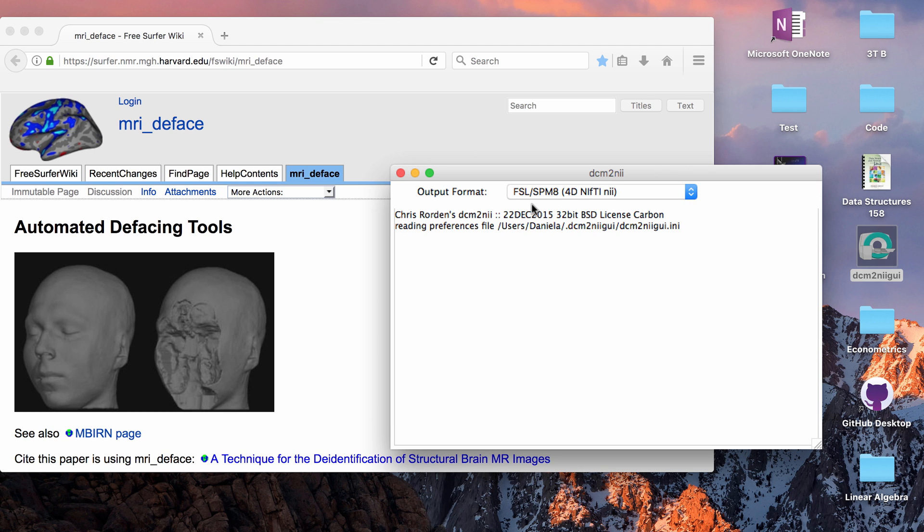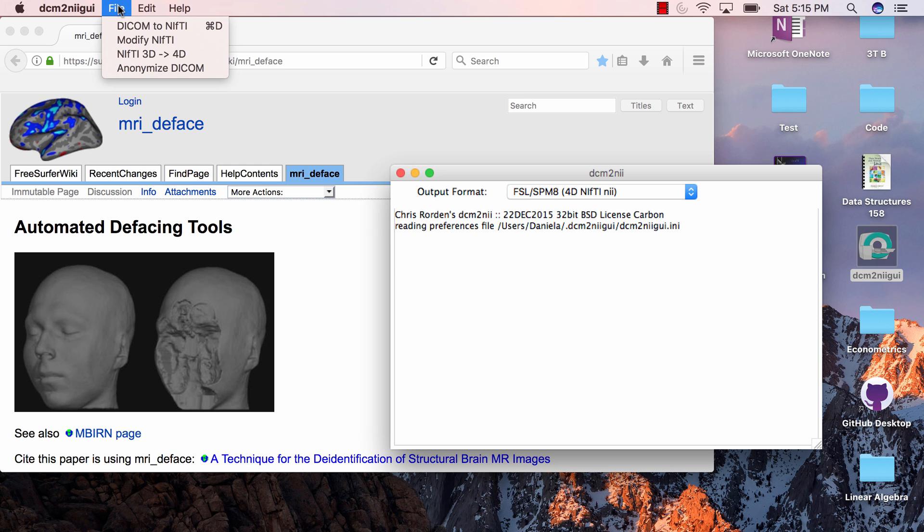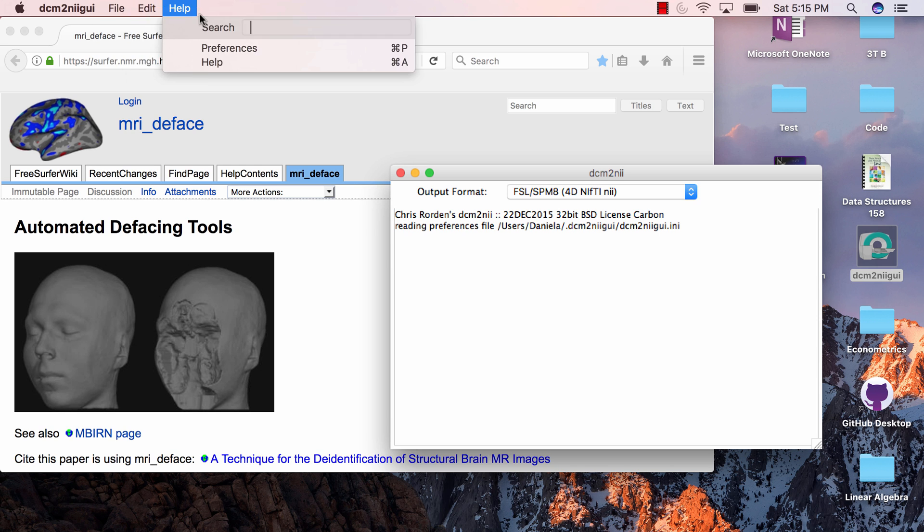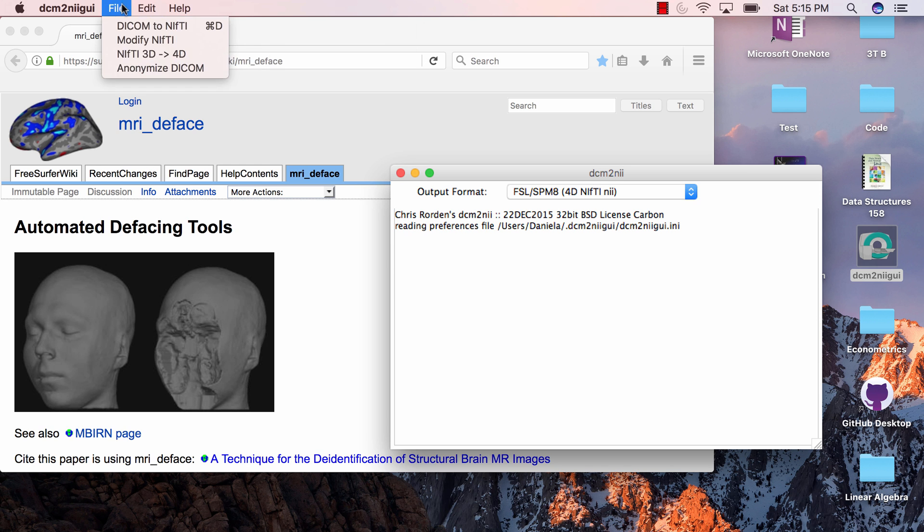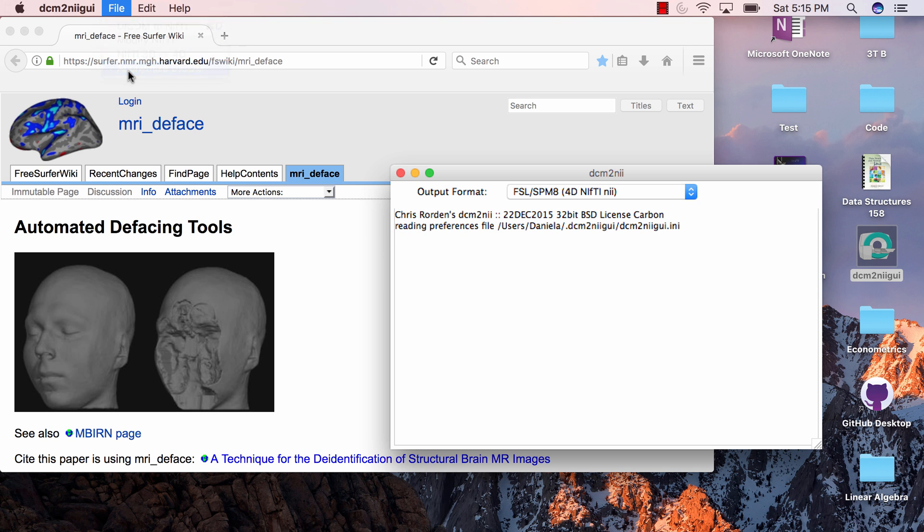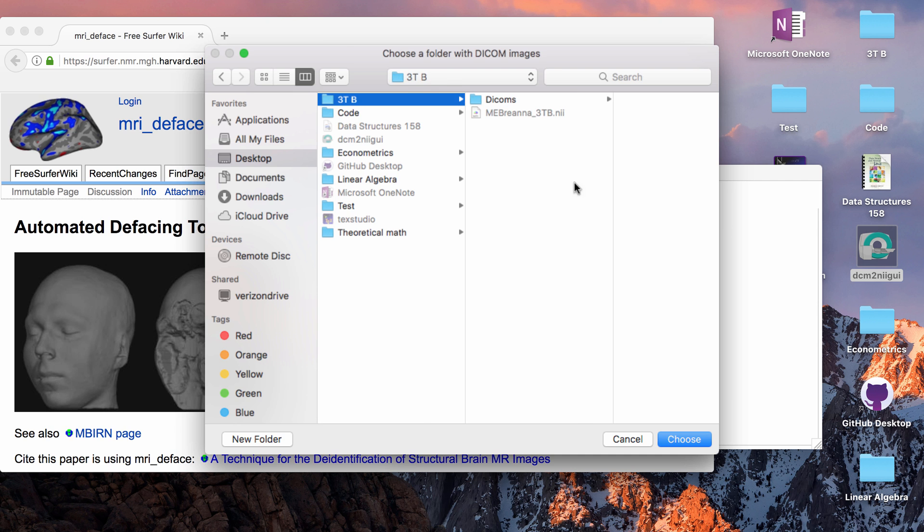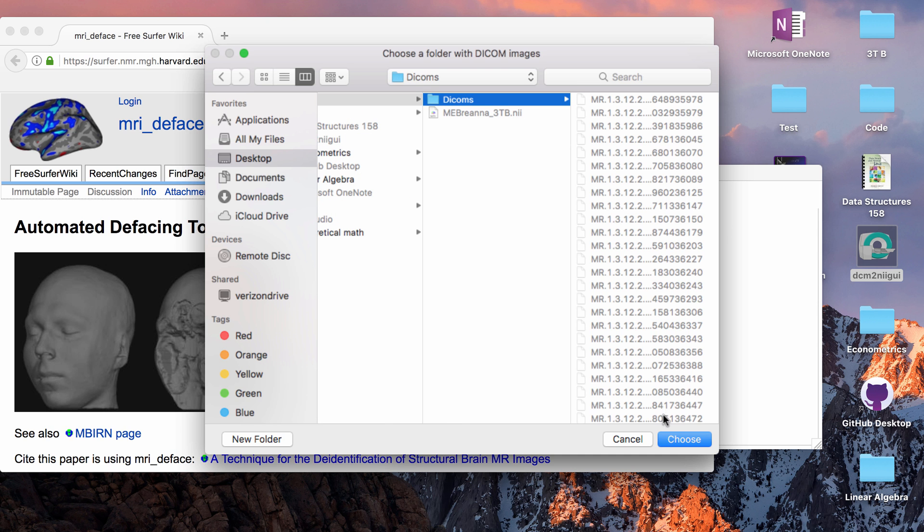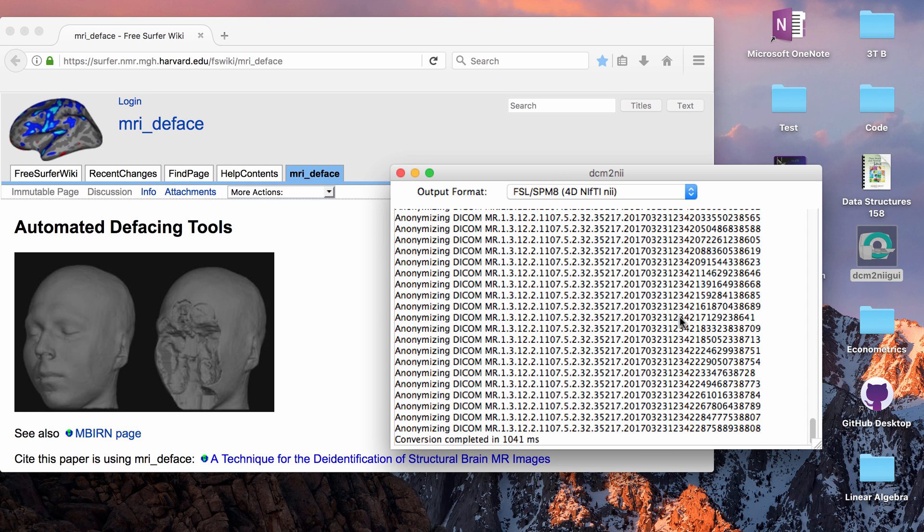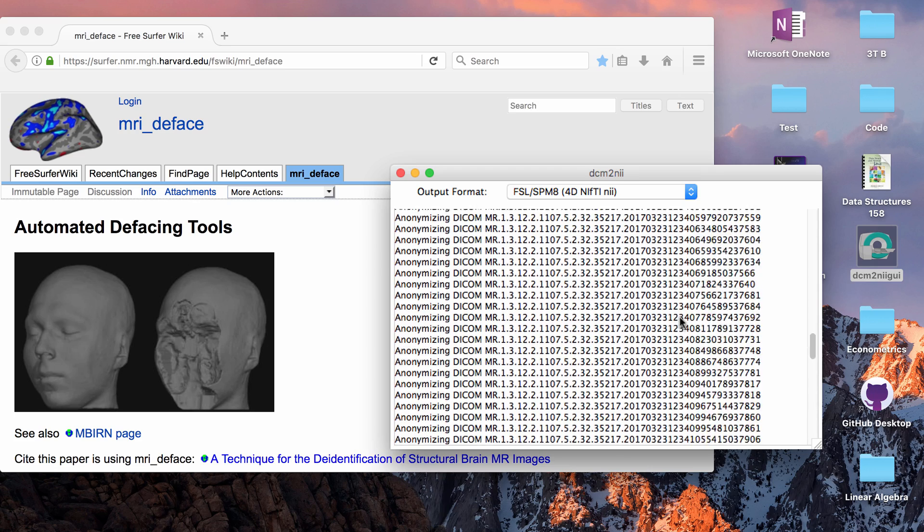If you open up DICOM to NIFTI GUI and then if you go to the task bar at the top and you go to file, there's an option to anonymize DICOM data. So I have some in this folder and you just say what folder you want and it really quickly does it.